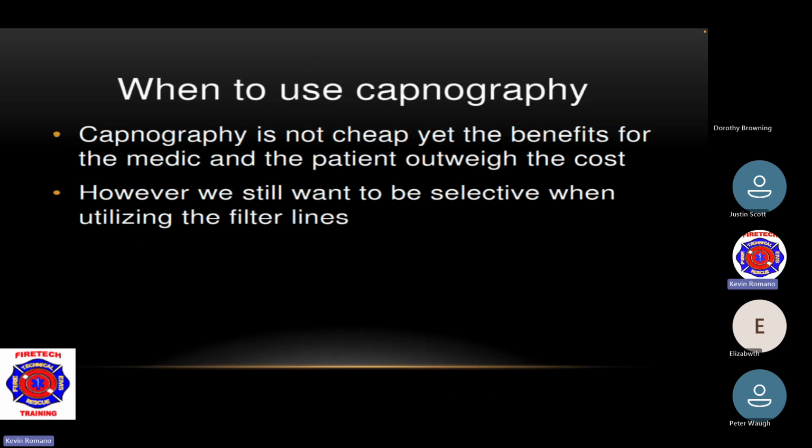So when to use capnography, to kind of finish up here, capnography is not cheap, yet the benefits from the medic and the patients outweigh the cost. I say medic, EMTs, advanced EMTs, paramedics, if it's within your scope of practice, please use it. However, we still want to be selective when utilizing filter lines. They are expensive, but you need to make sure you're utilizing them for certain patients.